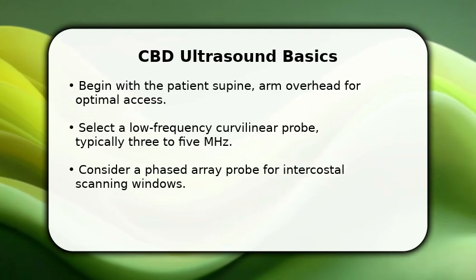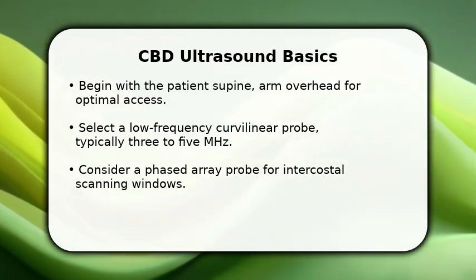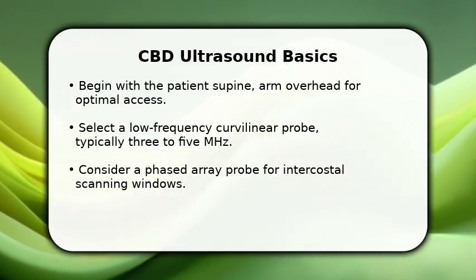In this video, I will explain how to scan the common bile duct using ultrasound. We will cover essential techniques to accurately visualize and measure this important structure.